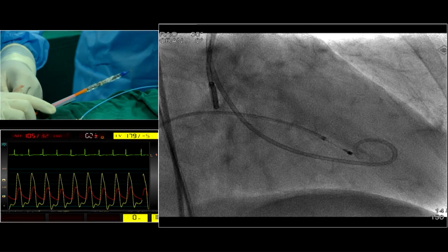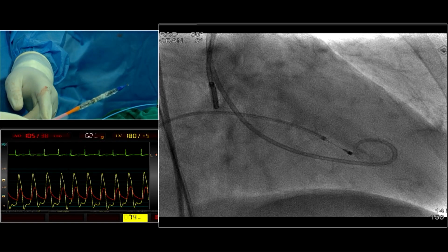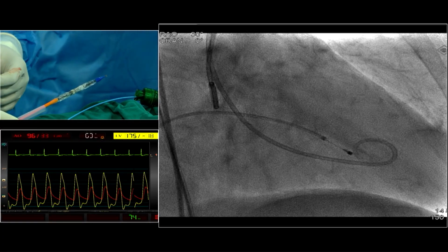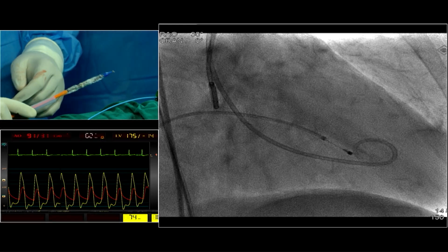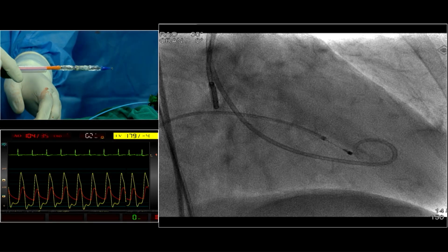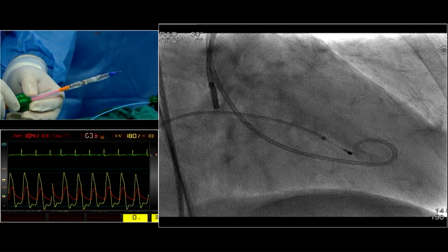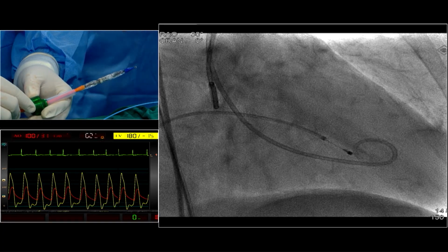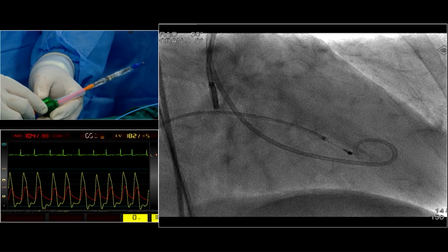Okay. So before we put a Safari wire in, we want to make sure that the valve is ready to use, because sometimes the Safari wire itself causes a lot of aortic regurgitation, and then we need to rush on. So it's best that you check the valve first. So you can see that the skirt is down, and this is a 21.5 intermediate size valve. Again, it's an advantage over the conventional sizes, because this patient has an annulus of around 20, and it's best to get a 21.5 for him, for her. 20 would be too small and 23 would be too large.